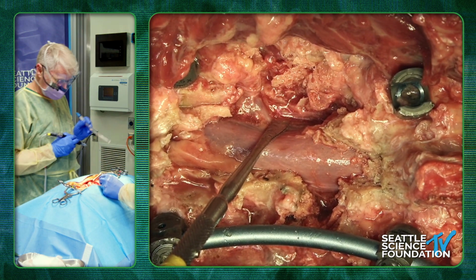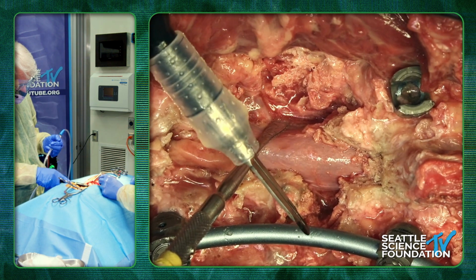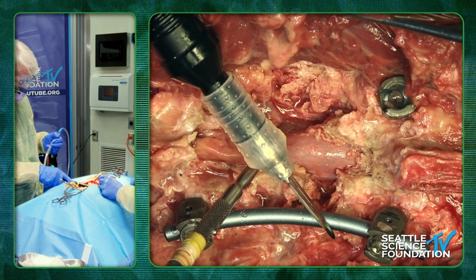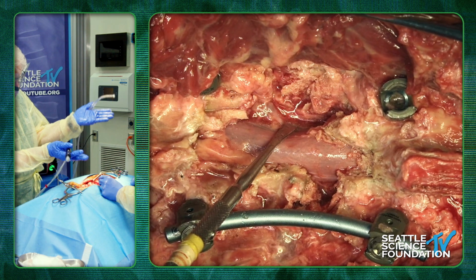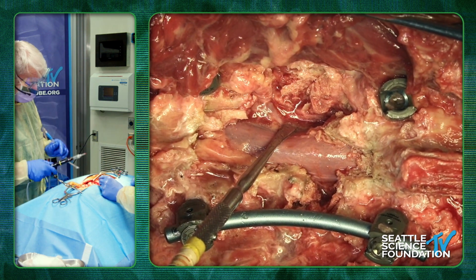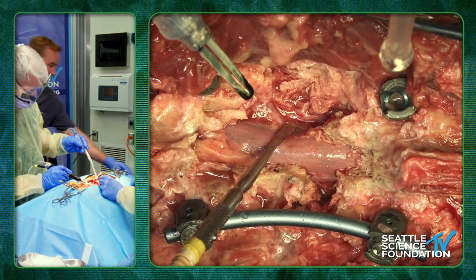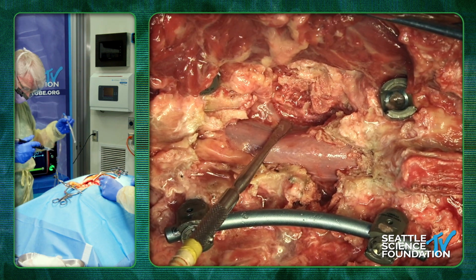So I'll use the Midas to get started. Now what I'm going to do is a hemi PSO, so I'm going to be aiming it this way. So all my cuts are going to be going that way. And if I want to do more lordosis correction, then I'm also going to be cutting back to front this way instead of straight. If I want more like a VCR, I'm going to cut it straight. If I want some sagittal correction, I'm going to cut it at an angle. So this cut's going to come from here.